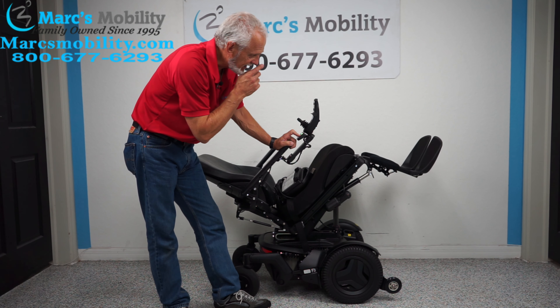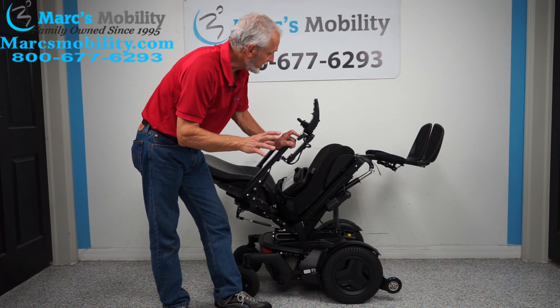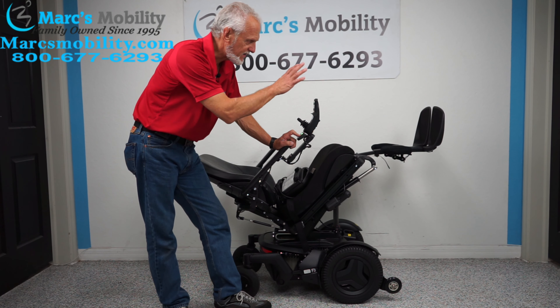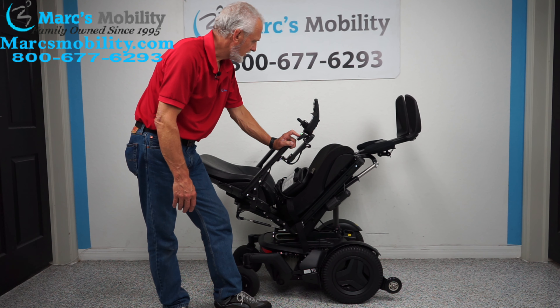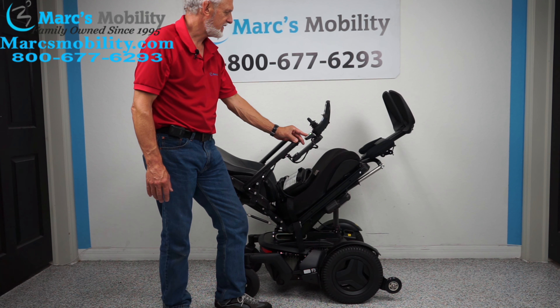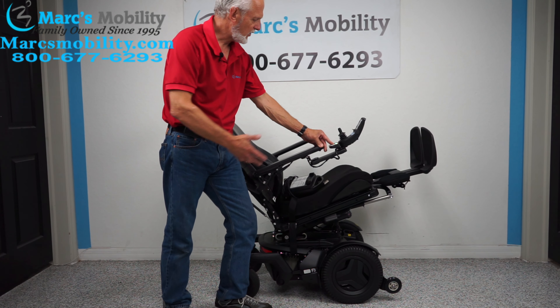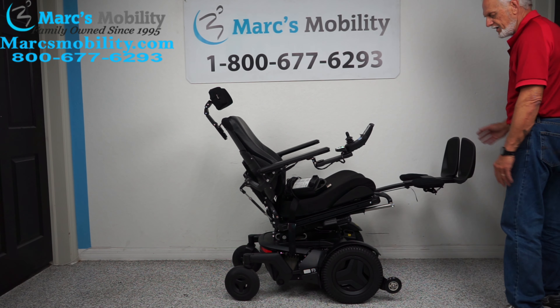The next feature is the electric legs, or electric feet. If you wanted some really good circulation, I want to show you what it looks like. This would be a little extreme, but you can actually have your feet way up in the air. I'm going to bring the seat back halfway so you can see — even halfway down, your feet are still higher than your body.